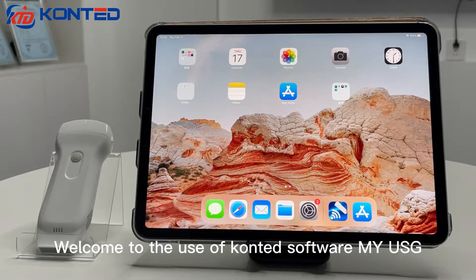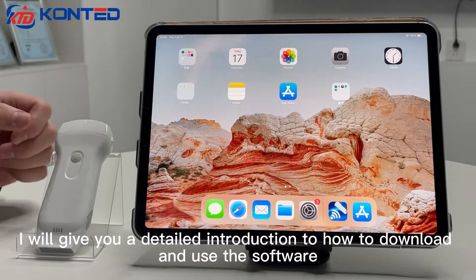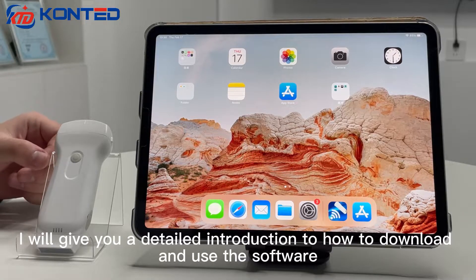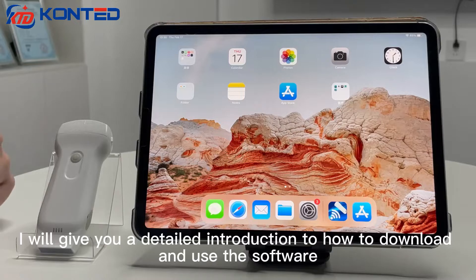Welcome to the use of Konted software MY USG. I will give you a detailed introduction to how to download and use the software.